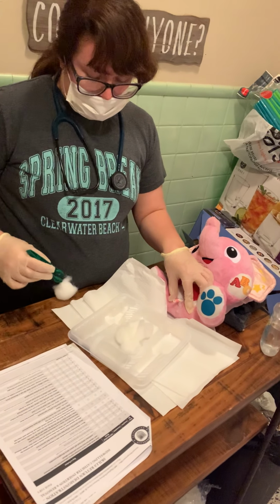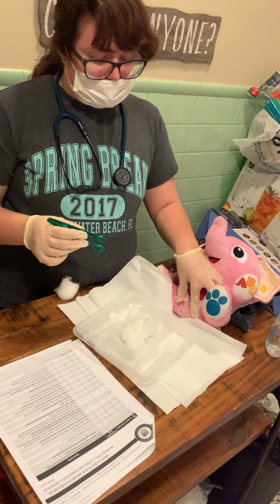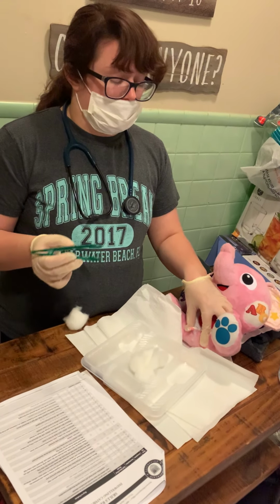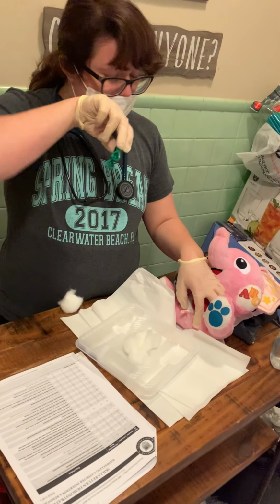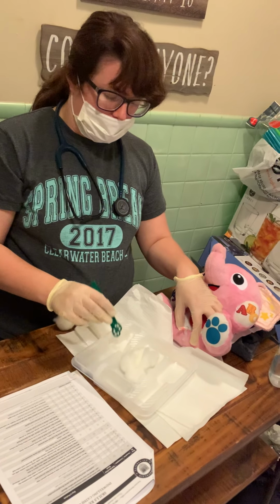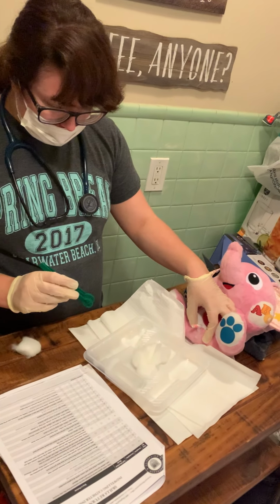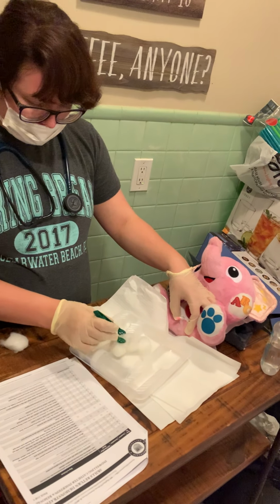But I'm going to be using this to spread the labia minora open, and I'm going to try to keep it there because if the flaps of the labia minora fold in, this is then considered non-sterile, and I would have to start over. So I'm going to clean along the folds.